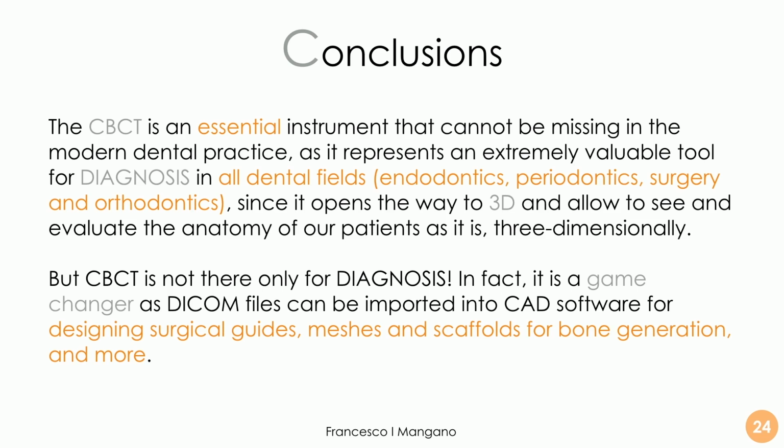The CBCT is essential for diagnosis, but at the same time, it is not only an essential tool for diagnosis, it's also a game changer for our treatment plans, because we can export the DICOM files from the CBCT, and we can import these files into different software. For example, in guided surgery, we can import these DICOM files into a guided surgery software, like the one I use, SMOP, for designing surgical guides, but also meshes or scaffolds for bone regeneration and more. I will show you more in one of the next lectures.